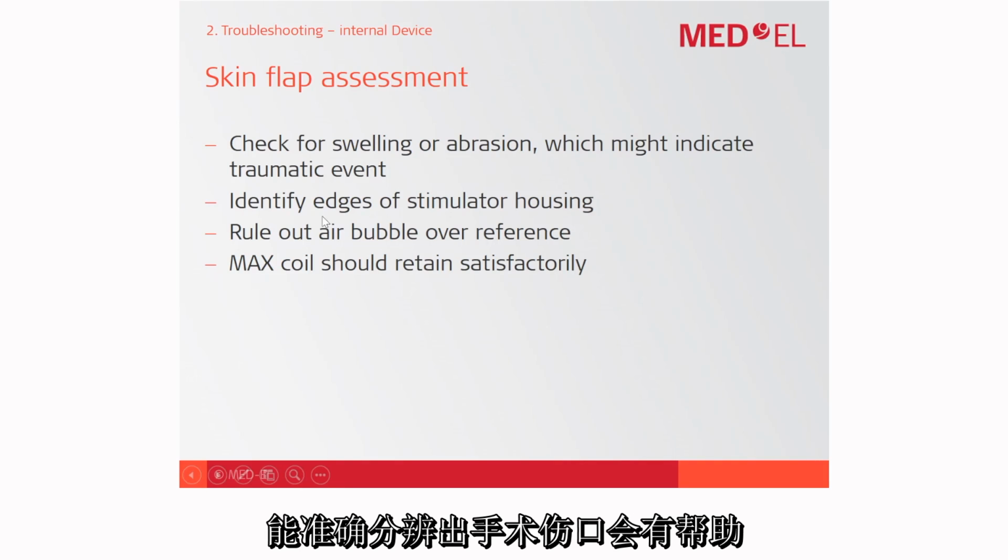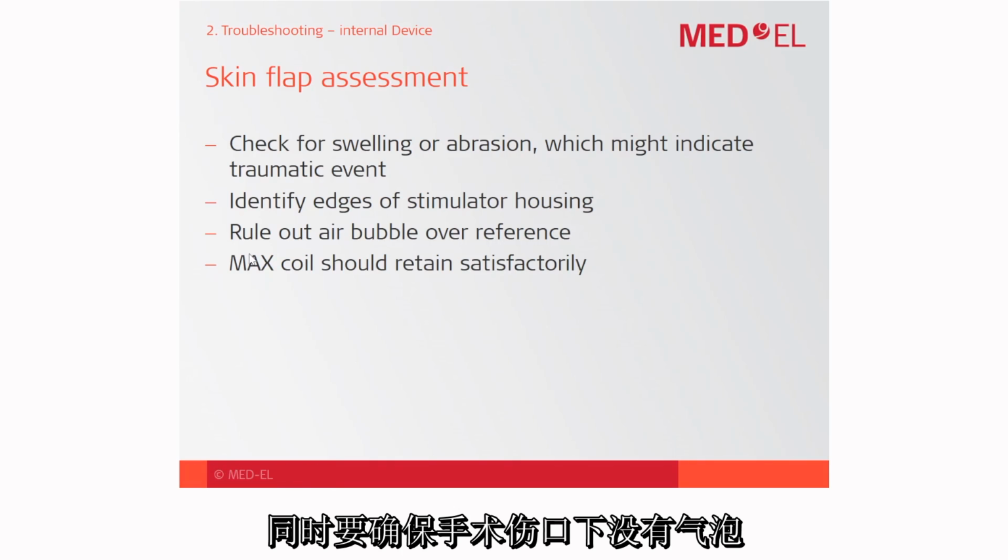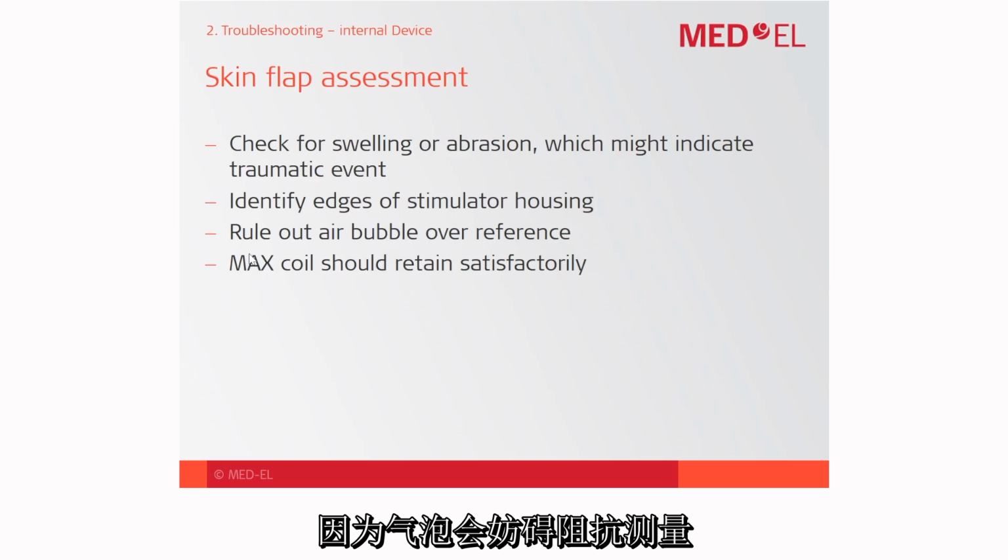So it's also helpful just to identify the edges of the stimulator housing. Then also make sure that not an air bubble resides over the implant housing, which may prevent you from measuring impedances during telemetry. And also make sure that the max coil retains satisfactorily when put over the implant area.